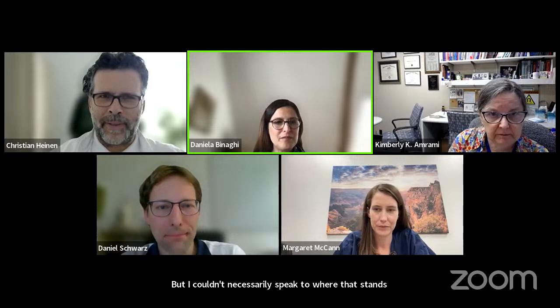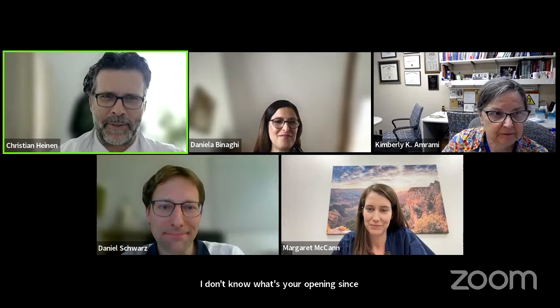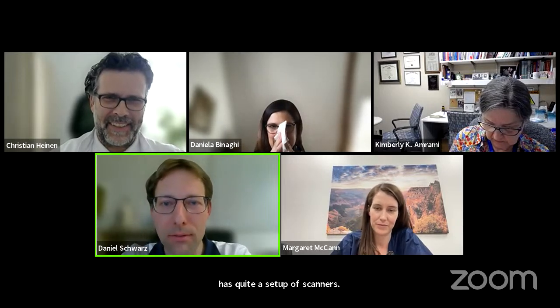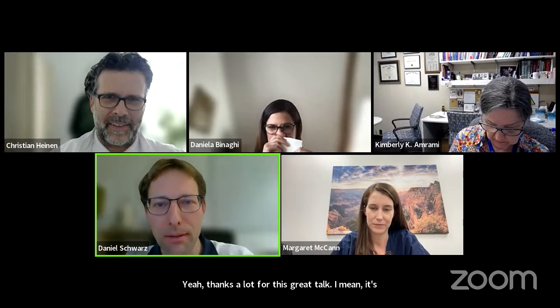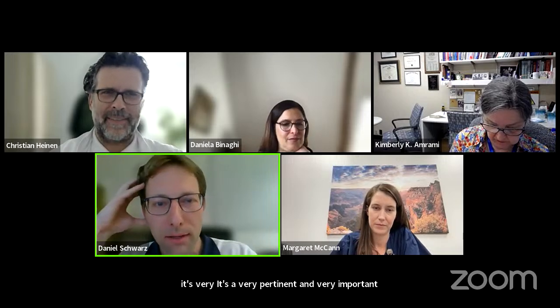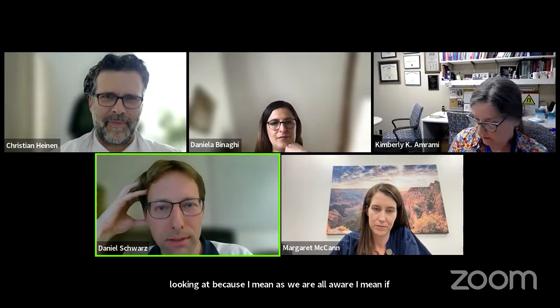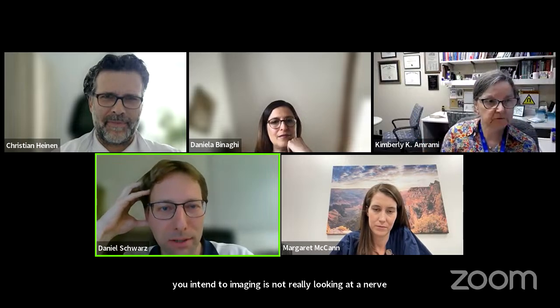Daniel, what's your opinion? Since the Heidelberg group has quite a setup of scanners, what's your impression? Yeah, thanks a lot for this great talk. It's a very pertinent and very important question to really correlate what we are actually looking at, because, as we are all aware, diffusion tensor imaging is not really looking at nerve fascicles, but merely some kind of simplification of what we are actually looking at.